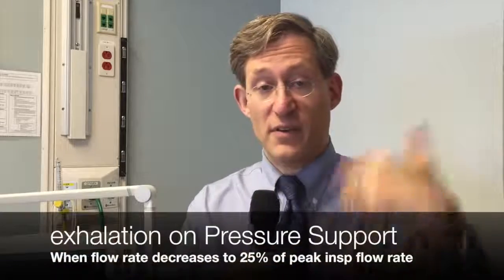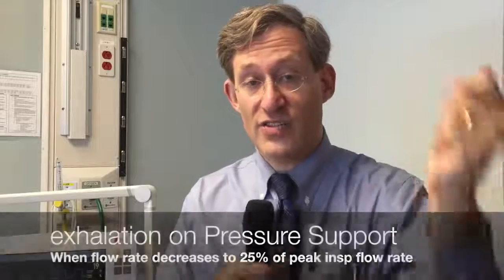And what the machine does is sense when you're taking a breath by the change in flow in the circuit, and then it quickly delivers flow until it gets to that pressure target that you've asked for, and then it starts to decelerate that flow. When the flow rate gets to 25% of the peak inspiratory flow rate, the ventilator shuts off and you exhale. That's what pressure support ventilation is. It's a very patient comfortable mode. It's a very patient friendly mode.